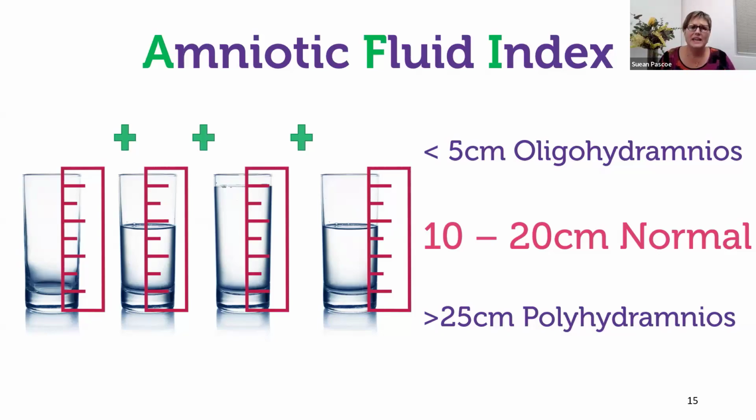Anyway, I saw that there was heaps and heaps of fluid. And our protocol at the time was that you did the fluid, you did the biometric measurements, you looked at the 4-chambered heart, I think, and the umbilical and middle cerebral artery Dopplers, and that was a complete scan. But I'd had a case not long out of student where I'd scanned a spina bifida child who that diagnosis had been missed during her pregnancy scan, so I was always paranoid about it.